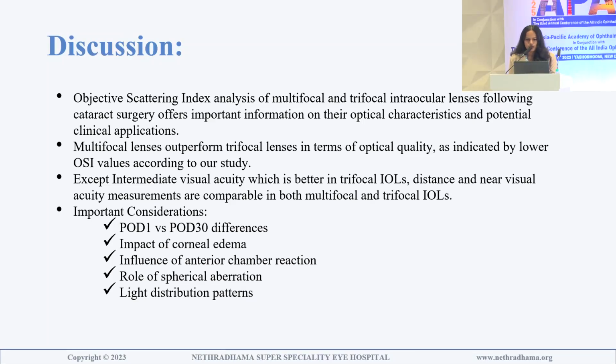Except intermediate visual acuity, which is better in trifocal IOLs, distance and near visual acuity measurements were comparable in both the groups. The important considerations in this comparison were the post-op day 1 versus day 30 differences due to the impact of corneal edema, influence of anterior chamber reaction, role of spherical aberration, and light distribution patterns.